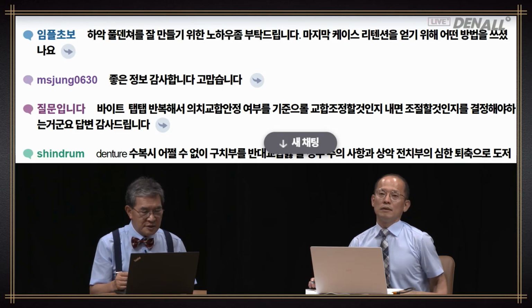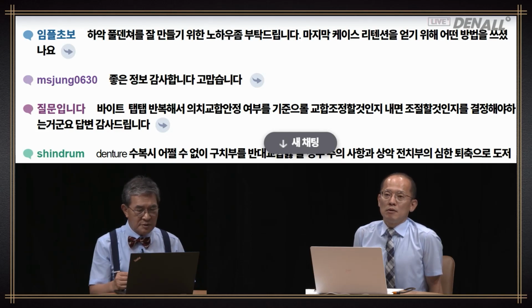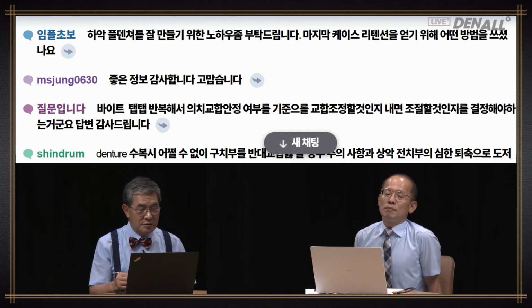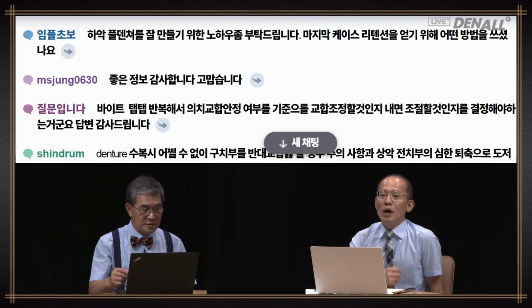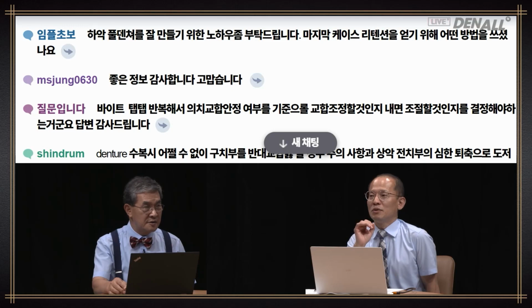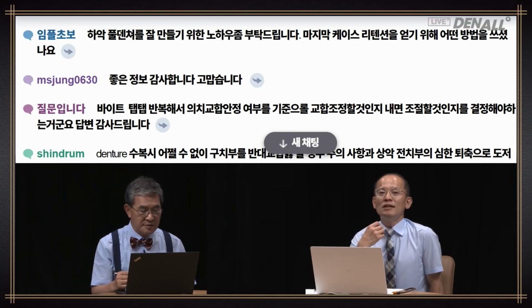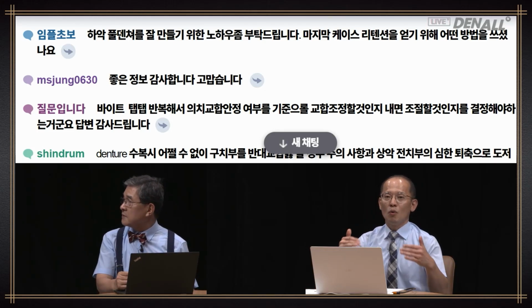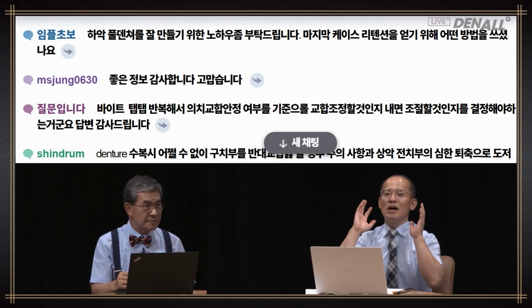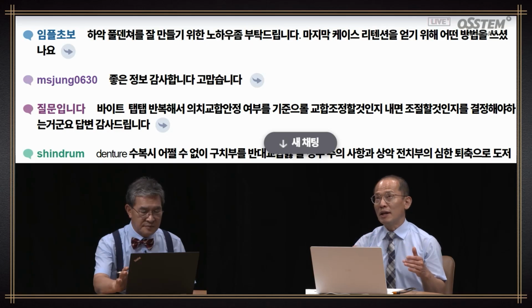And another viewer asks, any know-how to create a mandibular full denture well, and what did you use to gain retention in your last case? Well, basically, regarding retention, the patient factor has the strongest influence. So the tongue position, the technique, the appearance. Denture appearance needs to be in your mind. That image needs to be in your mind.